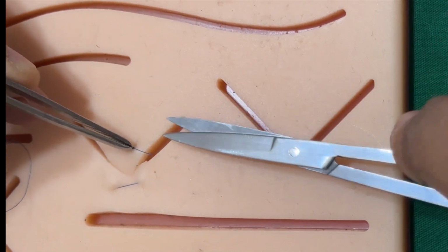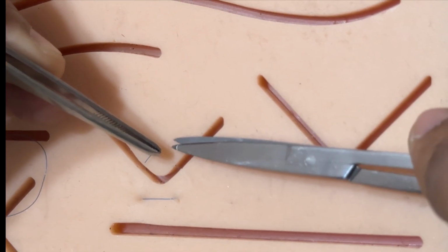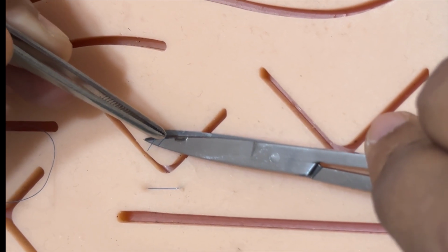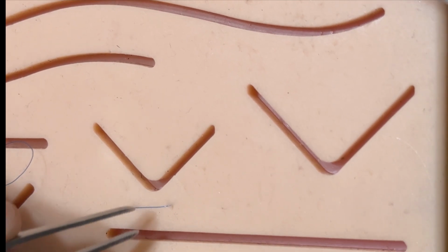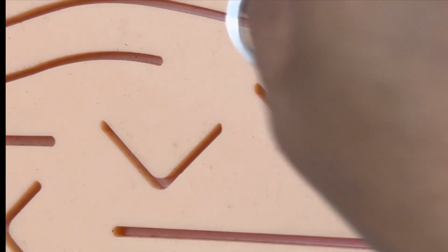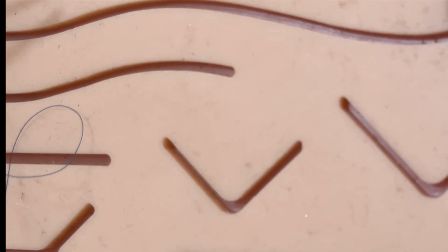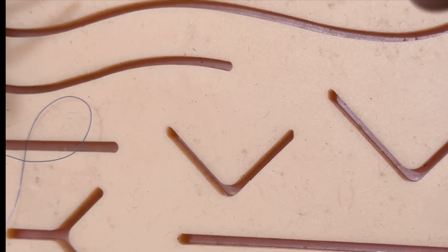Just hold it, and just below the knot you are going to cut it. Again, don't pull it. Now this part also you'll cut in a similar way as you have done for the removal of the horizontal mattress. Now hold this one and move towards the angle. This much clear? This is how you are going to do the horizontal mattress or mattress suture in a wound where you have an angle or corner.